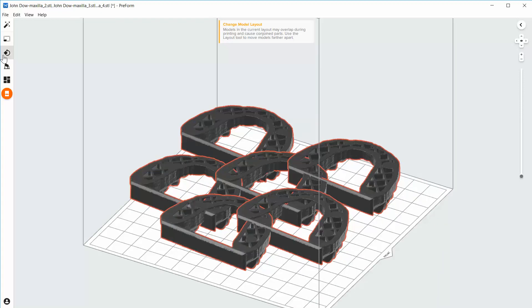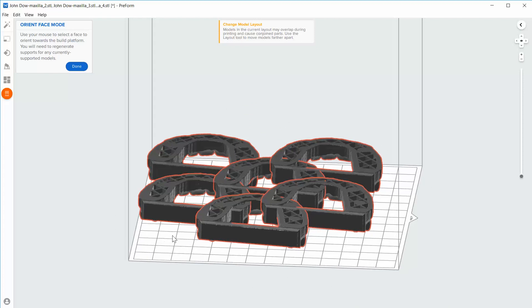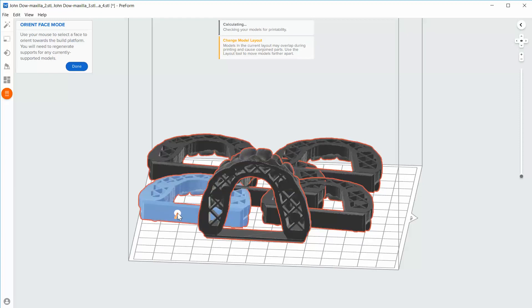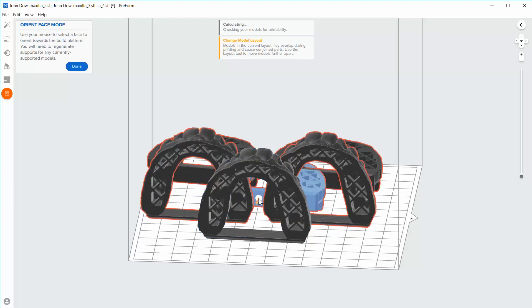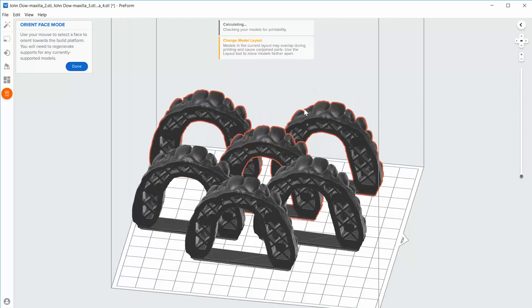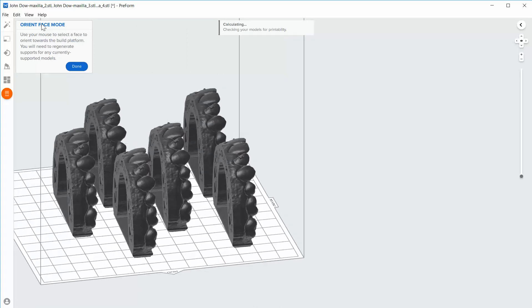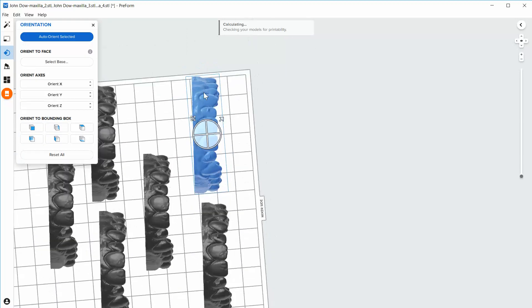I'm going to come over here to this little orientation menu and click on 'Select Base.' When I hover over a model, you'll see an arrow that points perpendicular to whatever it's touching. I want it to be perpendicular to the base, so I click there on each model. Now all models are upright the way I want them to print. I click done because I'm done with that step.